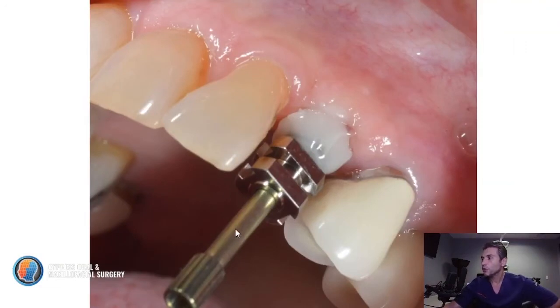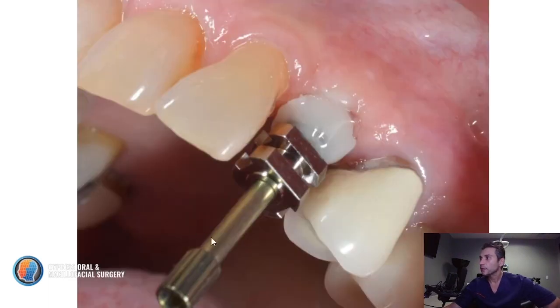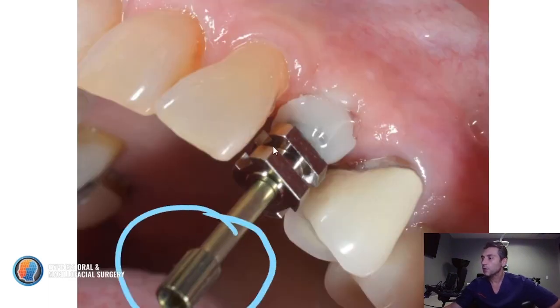This is an open tray. You screw it in, and then you have to make a hole in the impression tray so this part comes off, because once you take the impression of this, this whole thing comes out in the impression. And so when the laboratory pours this, now they have an idea of what you want the soft tissue profile to look like. And in this case, it should look something like this. And so when they make a screw retained crown or even a custom abutment, they know exactly how you like it.